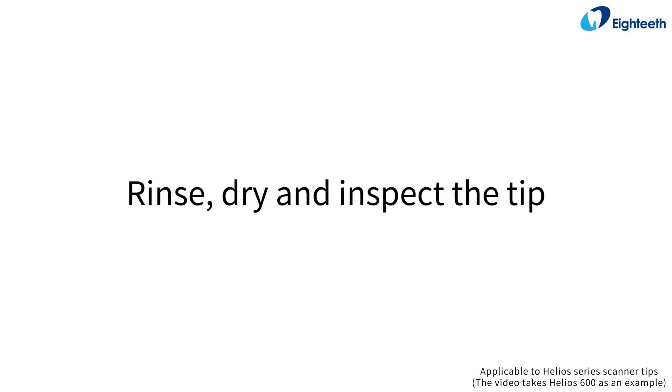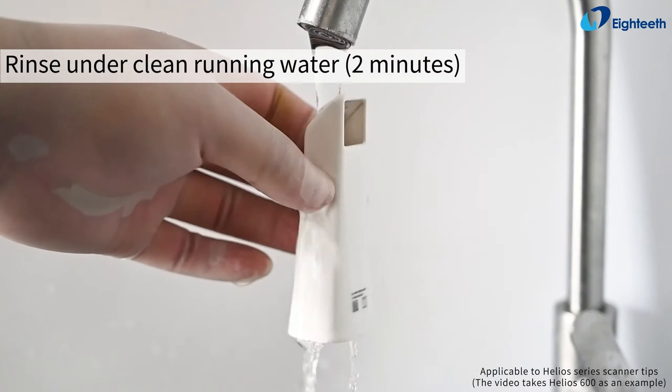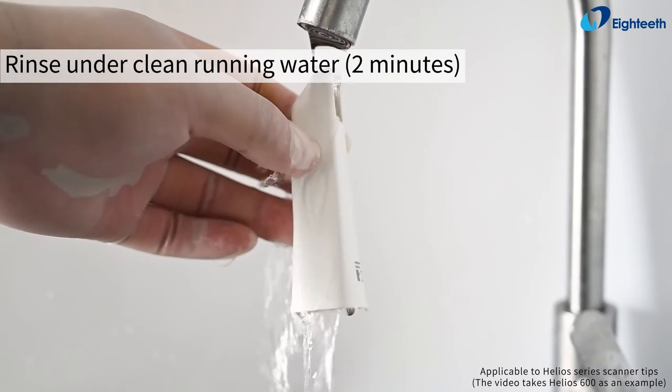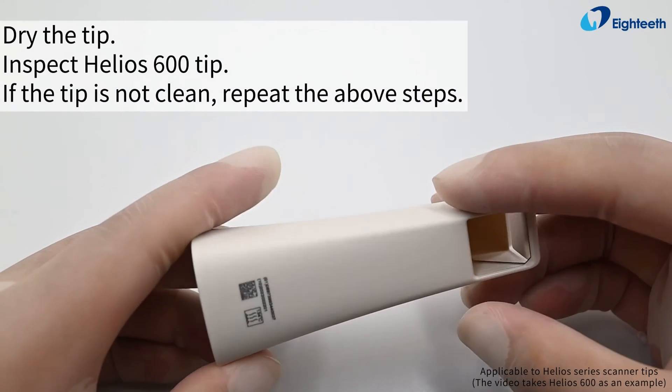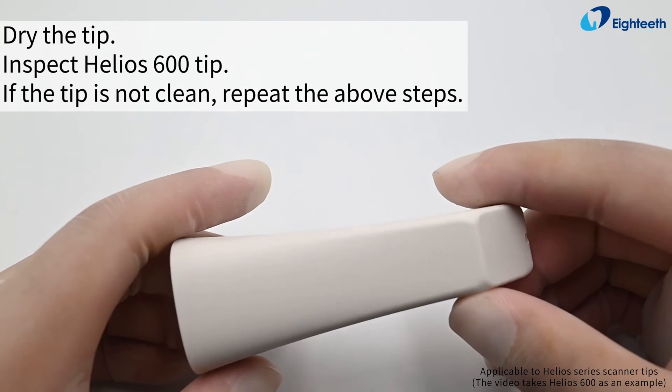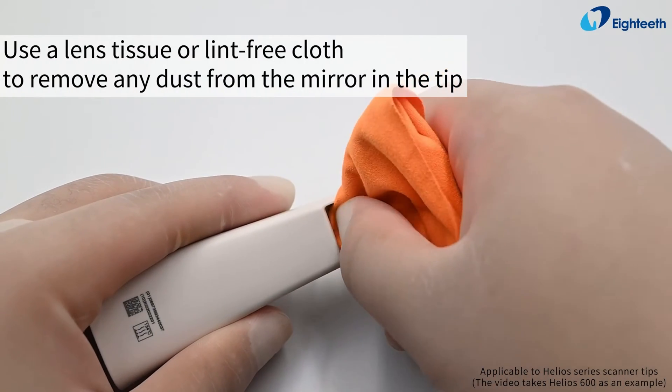Rinse the tip under clean running water for two minutes, then dry and inspect the Helios 600 tip. If the tip is not clean, repeat the above steps.